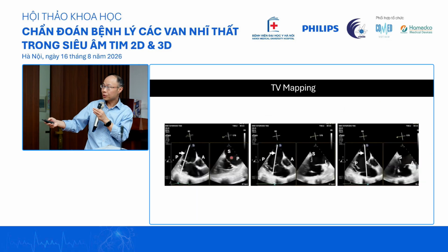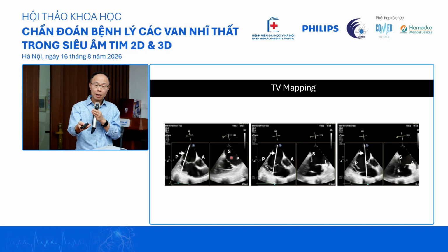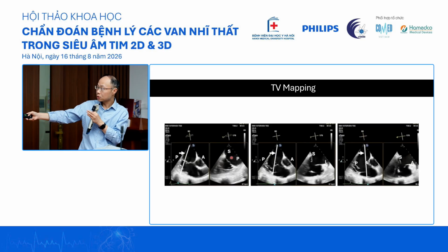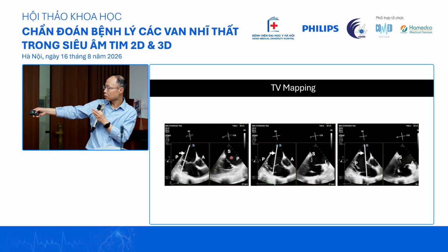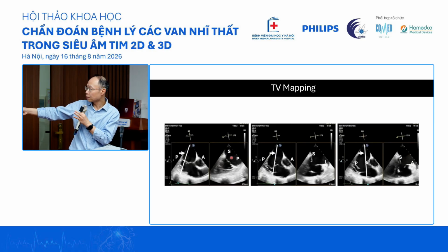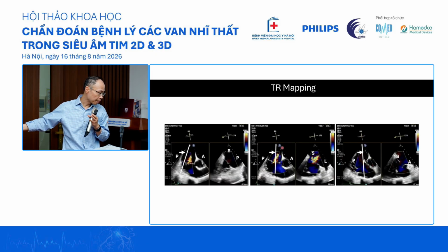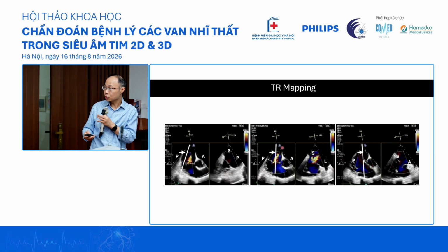And this is just a rehash of what I think is worth trying, especially if you're going to embark on a tricuspid clipping program. Make use of the X-plane to decide where the severe TR might actually emanate from. Again, this is anterior and septal. If your entire severe TR is concentrated here and you have enough leaflet length, which I believe Professor Kong may share with you, this is where we have the highest success rate to clip. So I will stop here and I welcome any questions from the audience.